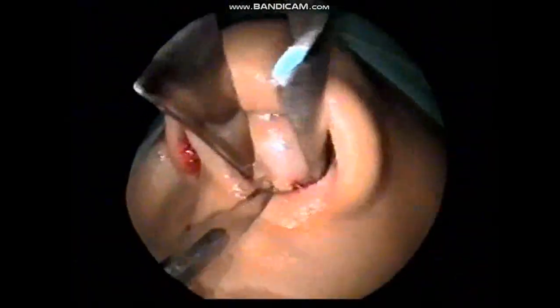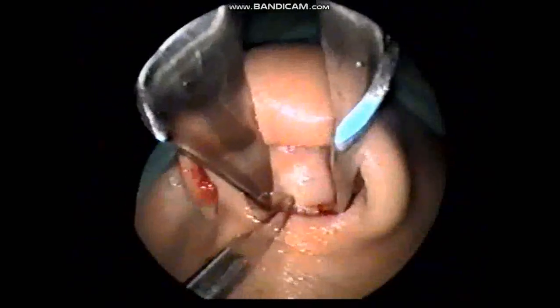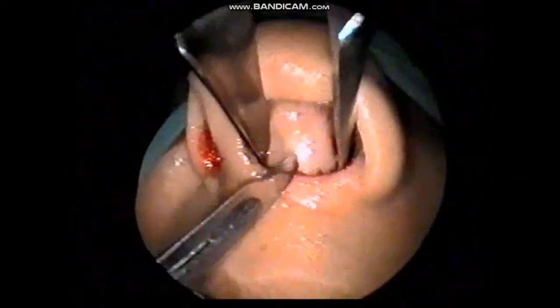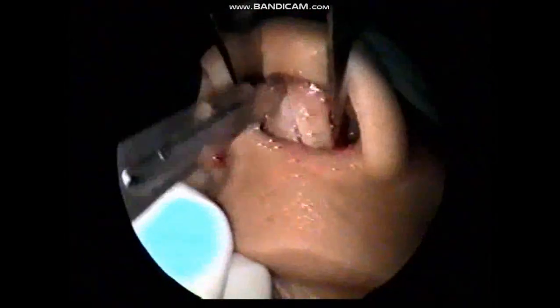After the local infiltration, a Freer's incision is made on the anterior part of the nasal septum. You can see the incision being made from below upwards on the anterior margin of the septal cartilage. Care being taken to see that the blade is held in the upward direction and the incision is carried on to the septal cartilage, anterior surface of the septal cartilage. A good incision helps in the elevation of the mucoperichondrial flap.